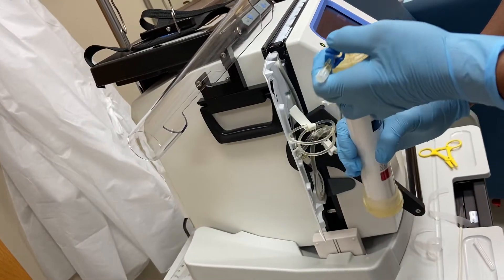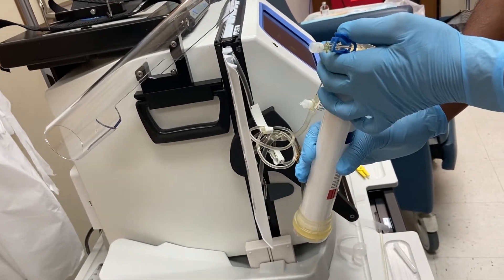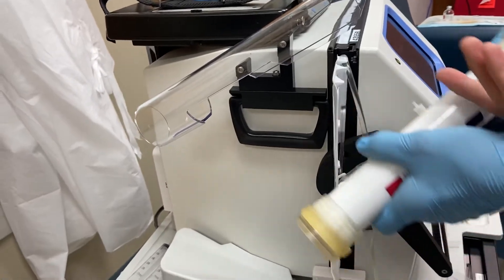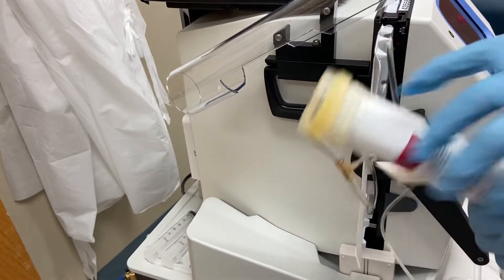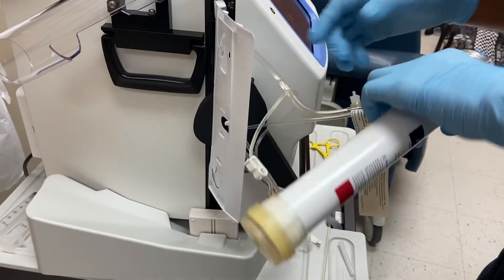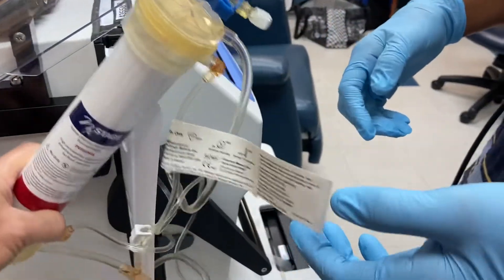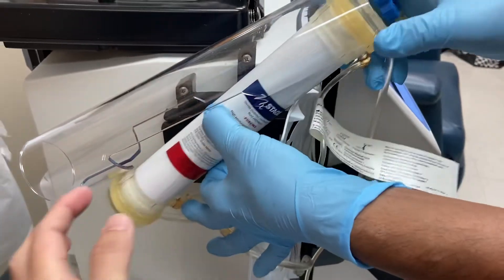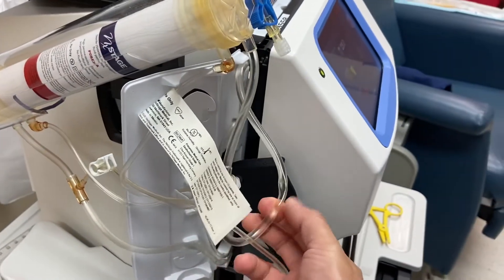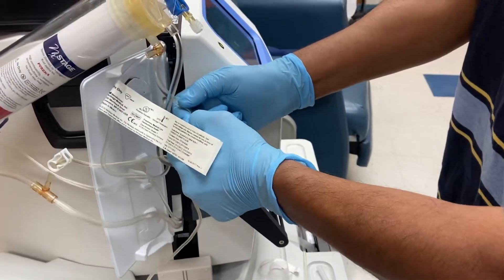Lift the dialyzer, then flip it like this. Now go like this to correct the position. There's a dent here — twist to correct that dent, because it may affect the flow.